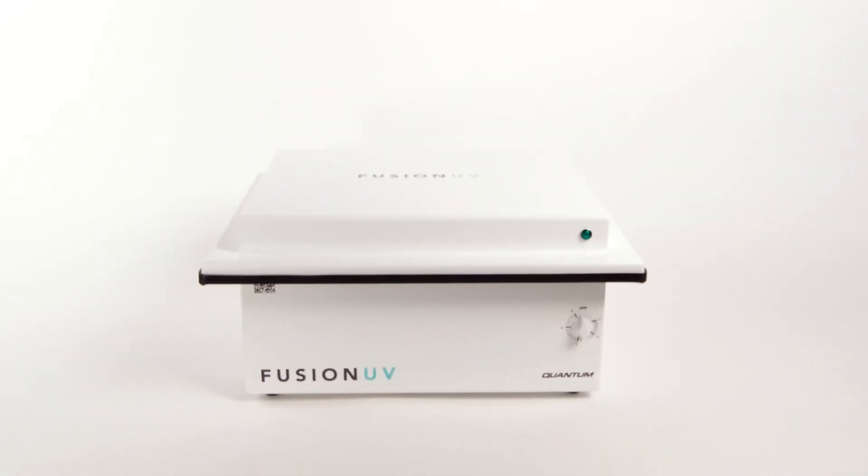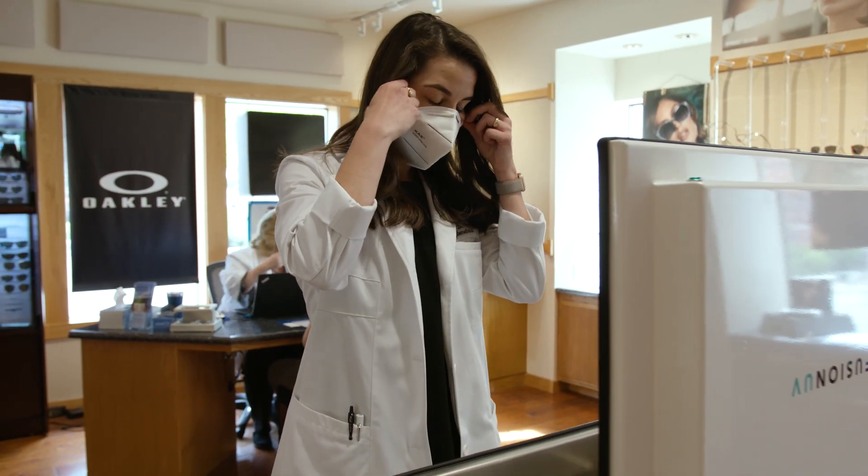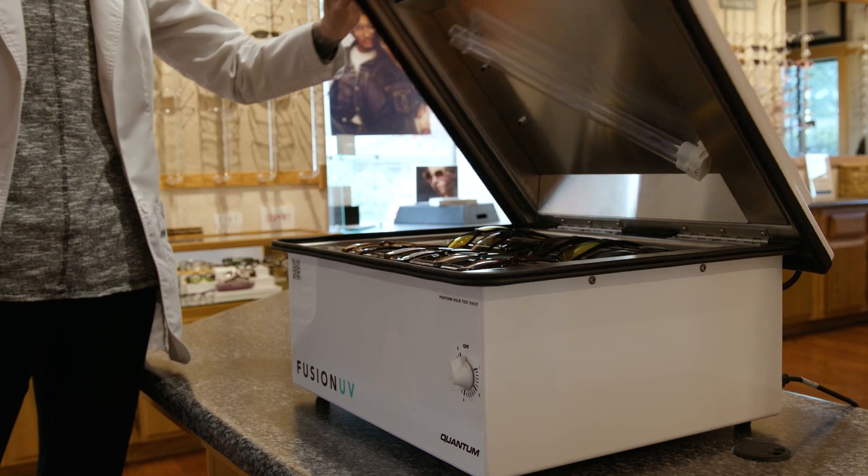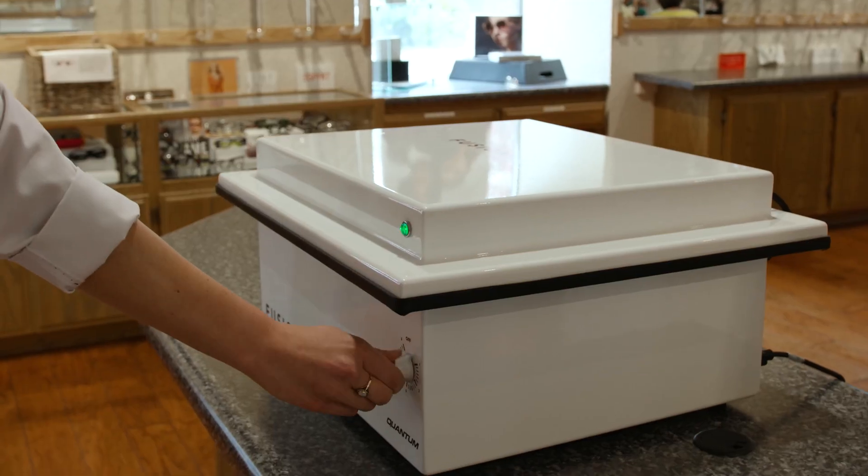Introducing the newest product from Quantum Innovations, the Fusion UV. Now more than ever, optometrists and eye care professionals need effective disinfectant tools to protect the safety of their patients, clients, and employees.